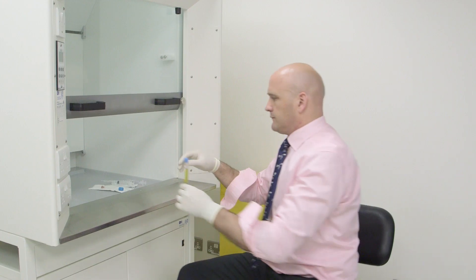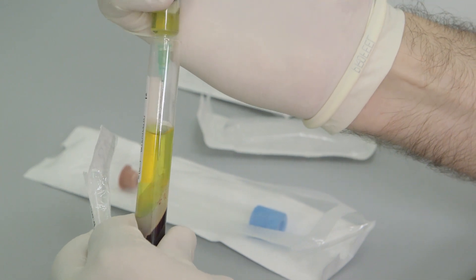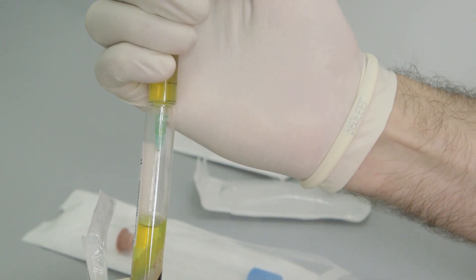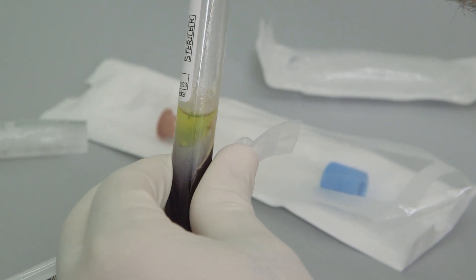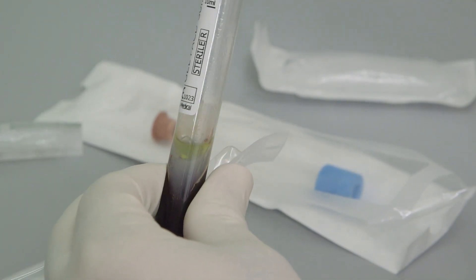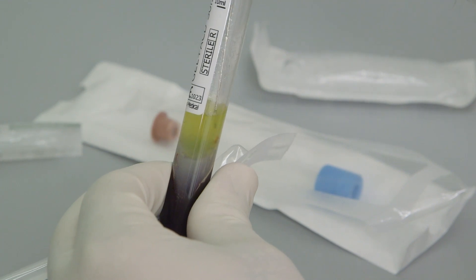On removal from the centrifuge, the area above the gel contains serum and the activated platelet clusters. The majority of serum is removed so that platelet concentration is increased. The platelets are then re-suspended, or re-added, to the plasma by mixing the solution.